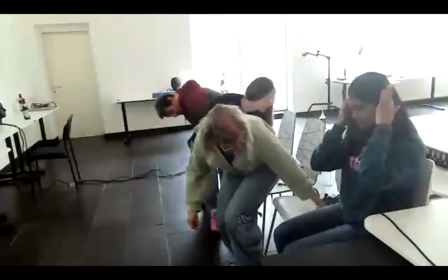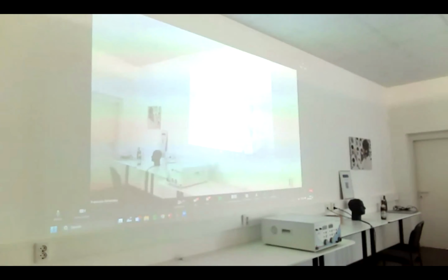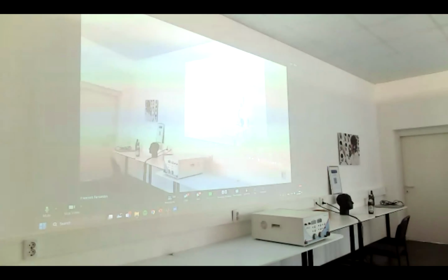So let me have a look here. So this is the setup. We'll have the subjects sitting in front of the projector. So we can see the projector here. They will have the paradigm coming there. So I can start the paradigm again so that you can see how it will look.